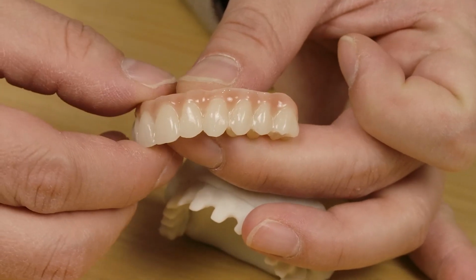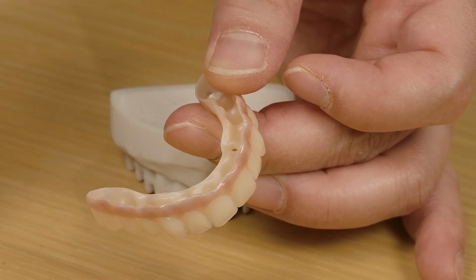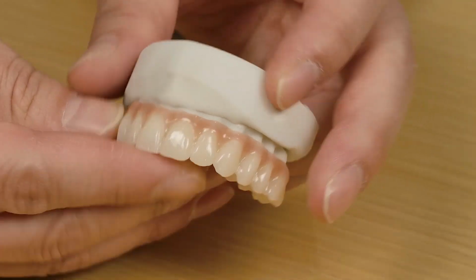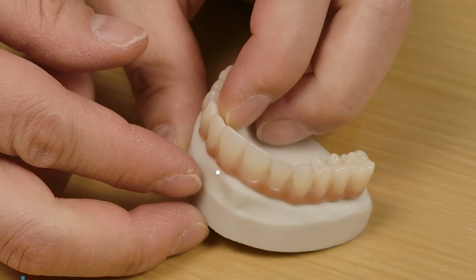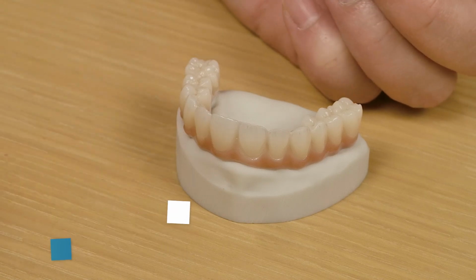And once they're done, I basically use Kuraray Panavia V5 opaque cement and condition the titanium surface, and then I'm ready to cement them once the titanium bar comes back to my office. And once the cementing is done, I take it away from the model and I polish them and finish it off.